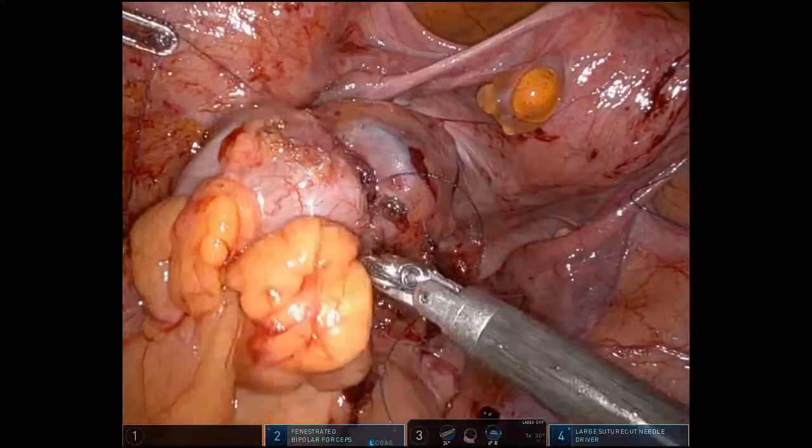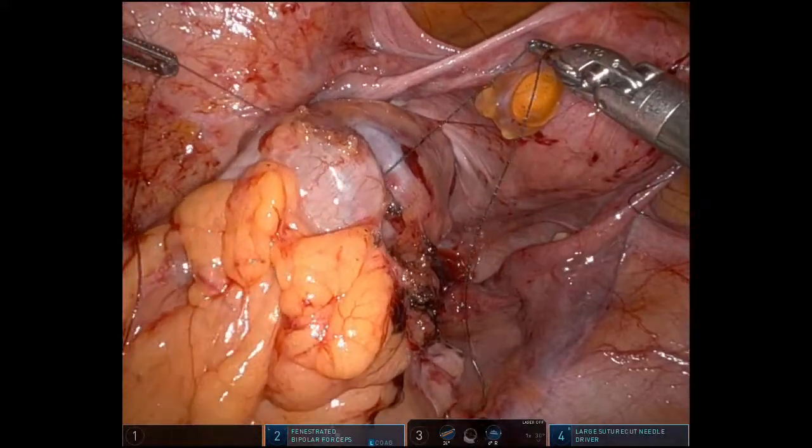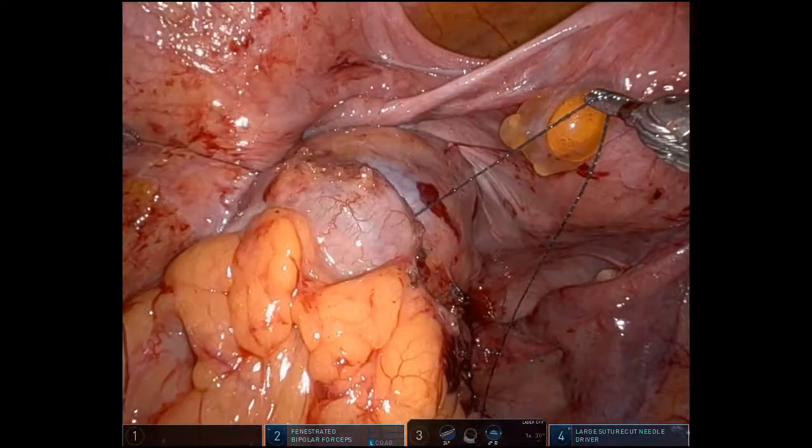This was our nicely done series showing how we deal with diverticulum at the anastomosis.